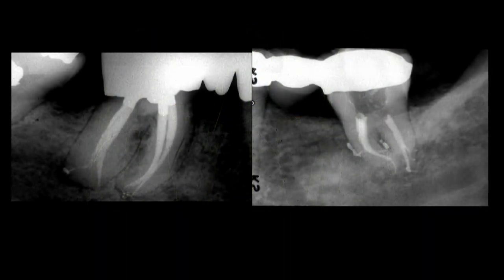And so what happens is when we had endodontic finishes, and these are from the 1970s, so I'm a 5 or 6 year old endodontist at that time. On the left, you see the mesial shapes are not perfect at the end. They're just different, bumpy, thin. And the patient on the right was kind of a favorite result of mine for quite a long time. But if you really look at the mesials, for example, they just, well, I guess you would have to say wimp out. They are not robust. And there may even be portals of exit apically that the hydraulics were not able to seal.